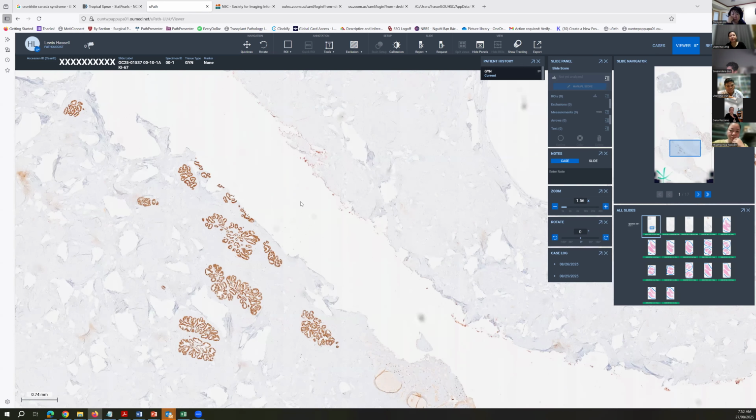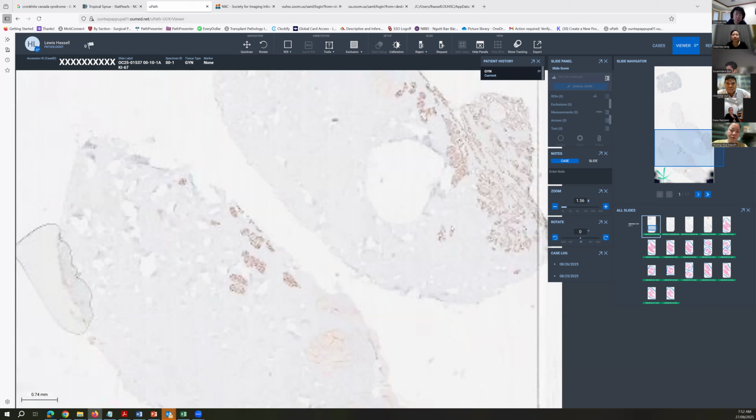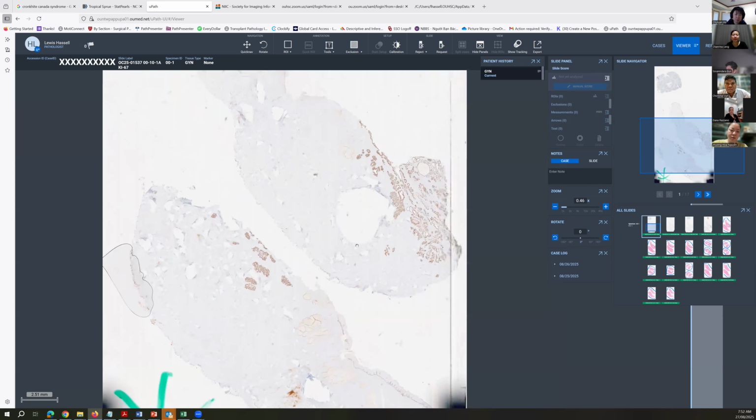Typically you don't see both or all four of these processes in one, but yeah, it's a very tricky area. One thing that I always do is when I see squamous dysplasia, just because that's more common, I pay a little bit closer attention to the endocervix to make sure there's no endocervical component. But yeah, it's really hard, I think, looking for these lesions.